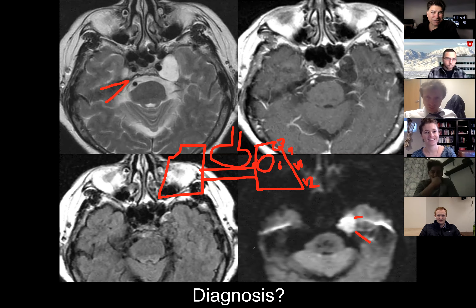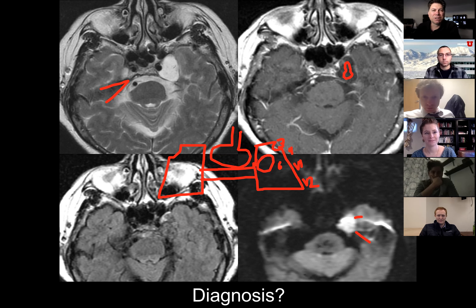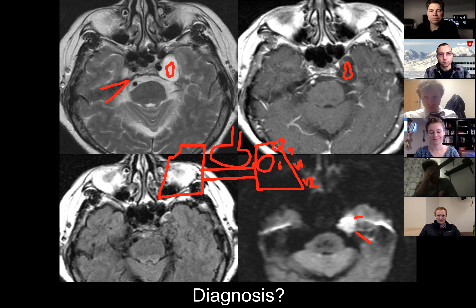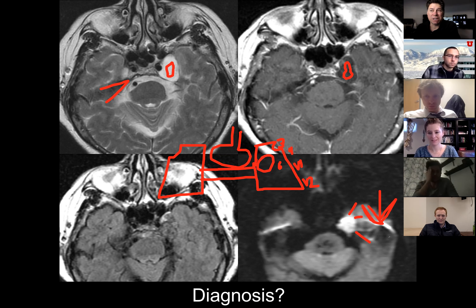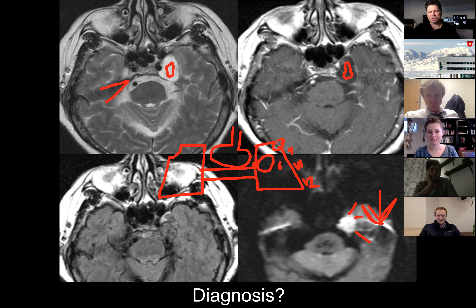This thing is actually not enhancing — it looks like it's fluid. What if it followed CSF on all sequences and did not restrict on diffusion? Then it'd be an arachnoid cyst. But because it's bright on diffusion and dark on ADC, this is an epidermoid cyst. What if this exact same thing were in the middle ear cavity? And what do we call something that looks like an epidermoid cyst but is centered in the middle ear? A cholesteatoma.